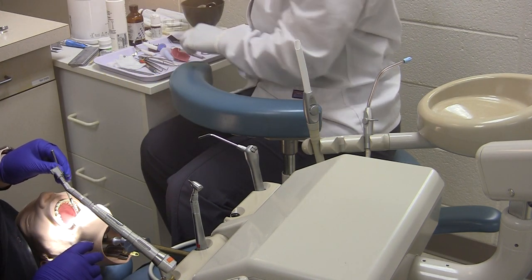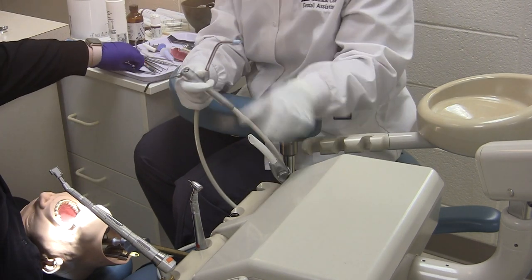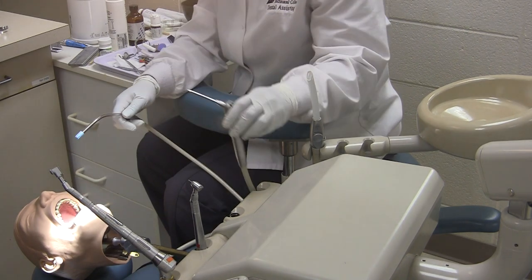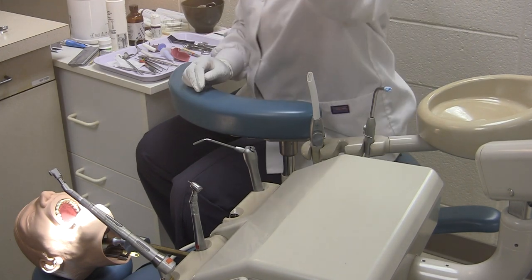Once everything is cleaned up nicely, the assistant will then perform a full mouth rinse and give the patient post-op instructions.